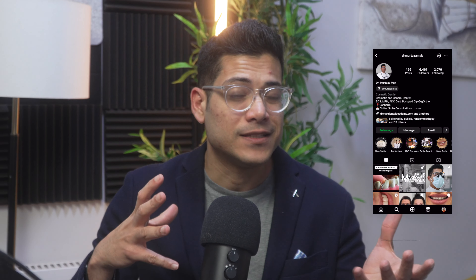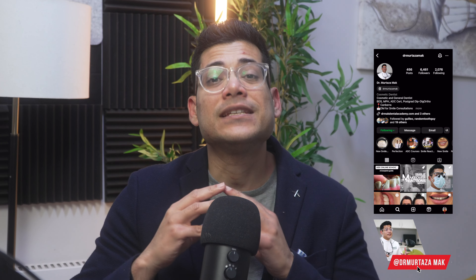Hi everyone, Dr. Mac with another video. Today's video is showing everyone how to do a wax-up or a mock-up when you're doing any porcelain veneer case. Now I just follow the same protocol even if I'm doing a resin smile makeover, but this is very important for everyone to understand.